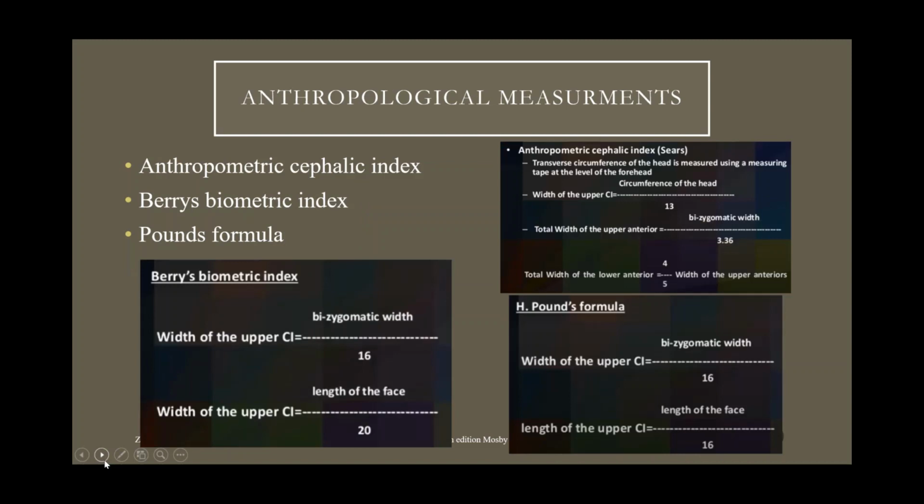Then the next method is using the anthropological measurements of the patients. Anthropological is nothing but a few authors have done studies from ancestors and they have come out with certain formulas to determine the size of the teeth.